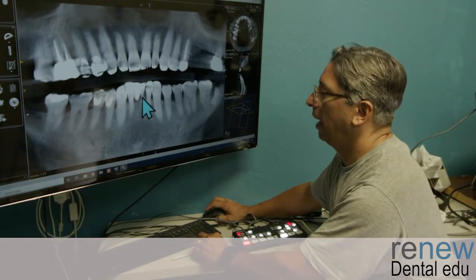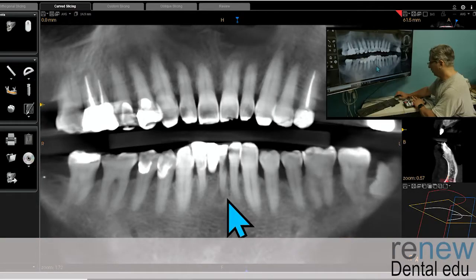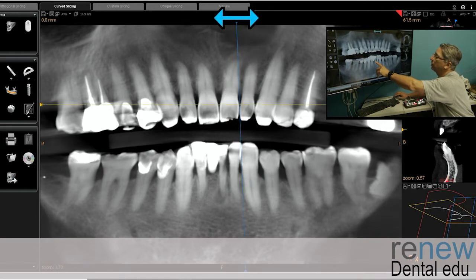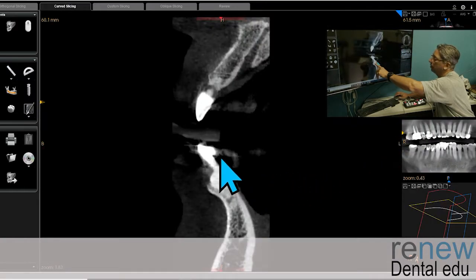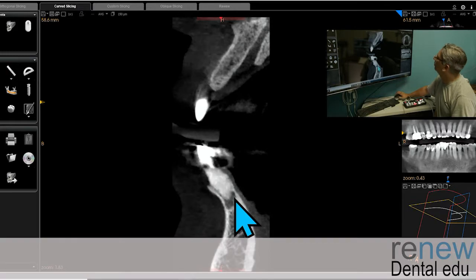Let's look at this area here first. This is the problem area here, and you could see that it's really chunked out when you look at it here. Let me move the cursor over. Probably not going to see, this is a good PA one. I don't have a PA, but here's that tooth cutting across right here. Oh my God, it's such a bummer. There's so much tooth structure missing.